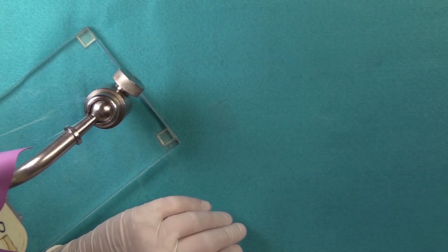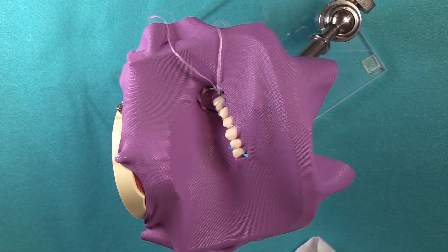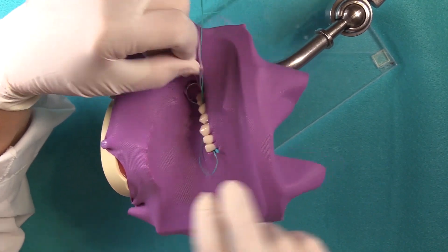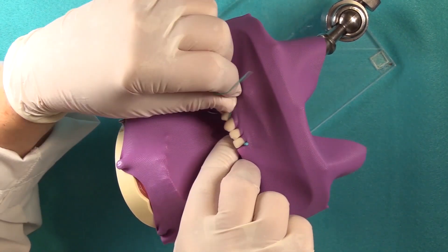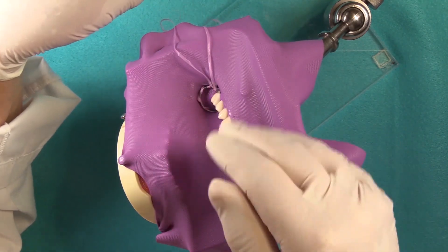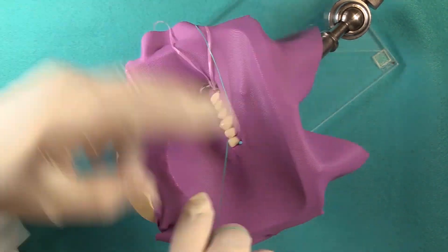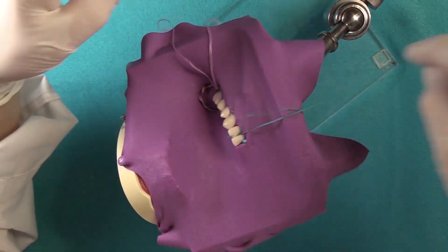Incorrect spacing is another issue that can cause leakage. When you're applying your dental dam, you want to make sure that the material is down between the teeth. The interproximal dental dam must be thoroughly between the interproximal areas. What I do is go back with some dental floss and basically floss the interproximals — re-flossing it, really. Make sure to suction everything dry. I'm showing you how I work when I'm working by myself, making sure that the dental dam material is down thoroughly.